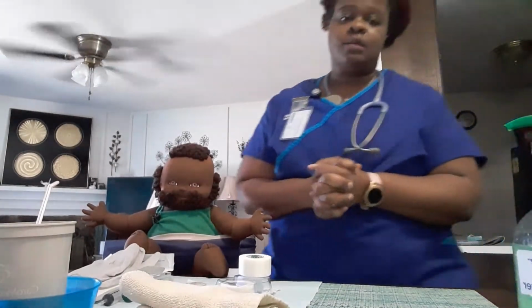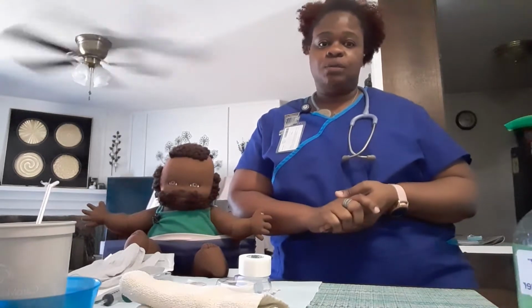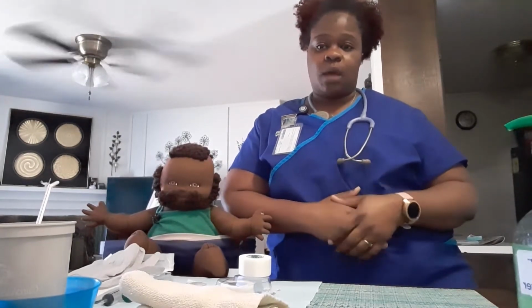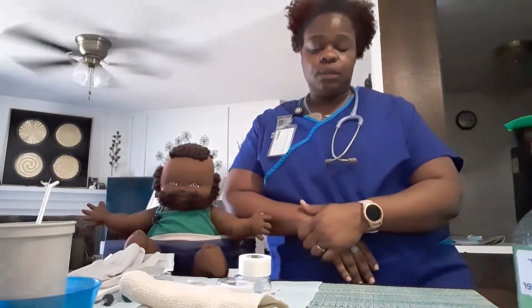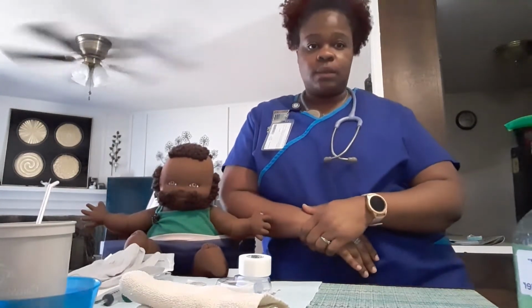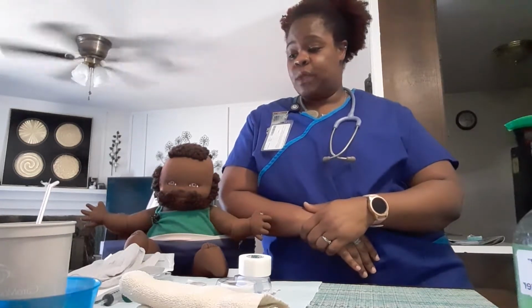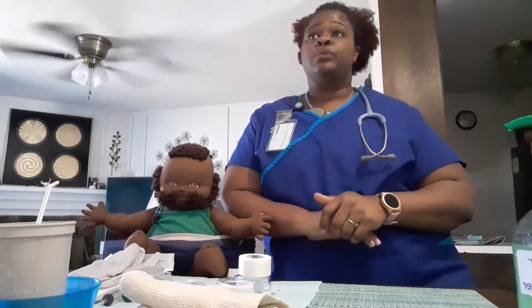I'm going to tell the patient the reason for this procedure is to help with decompression of his bowels because he's been having some hyperemesis. And I'll ask the patient, does he have any questions? And he said no. And then I would get consent to actually place the tubing from the patient. Next, I would let the patient know after 24 hours if his bowels are better, we would remove it.